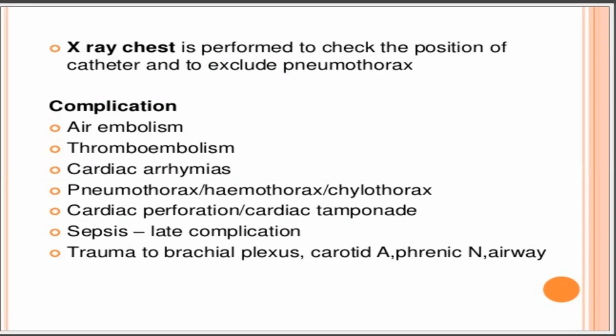X-ray chest. X-ray chest is performed to check the position of the catheter and to exclude pneumothorax, which can be the fatal complication of central venous catheterization.